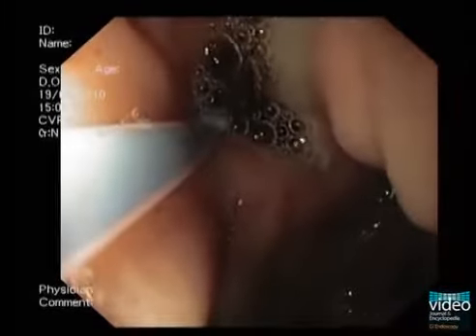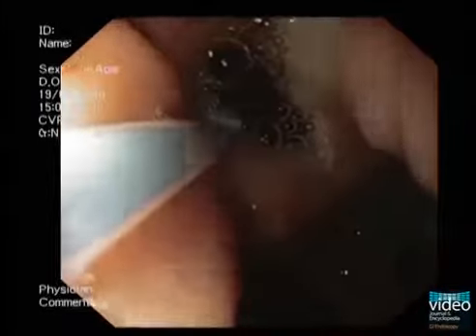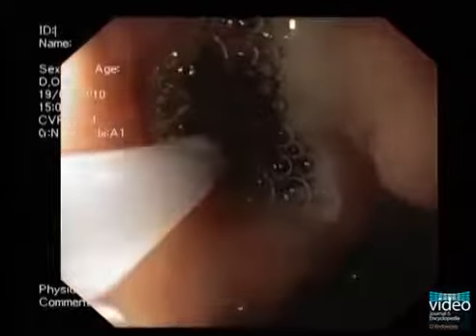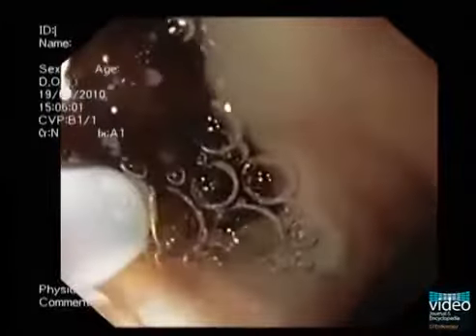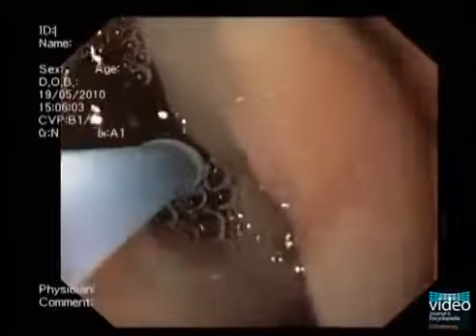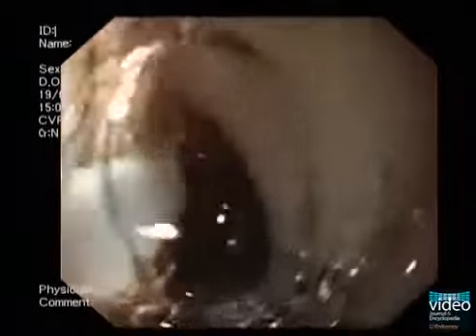By contrast, injection of a total volume between 13 and 30 milliliters is recommended in ulcers with active bleeding or a visible non-bleeding vessel in order to decrease the risk of rebleeding. Injection of more than 30 milliliters of diluted adrenaline is not recommended due to increased risk of perforation.